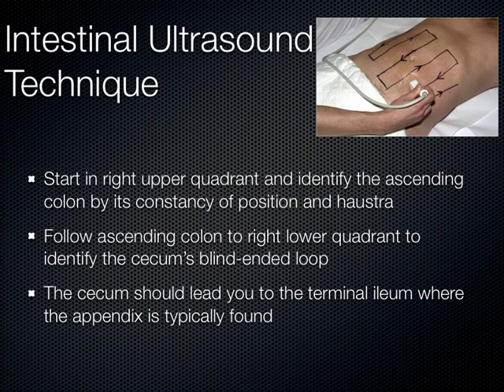Whereas in the small bowel, we have something called plicae circularis that do cross the entire wall of the bowel, which I'll show you in a minute. That's how we can quickly decide between small bowel and large bowel on any imaging study, looking at haustra versus plicae circularis. That sounds like minutia, but it actually comes into play quite a bit in most fields, so it's something you might want to remember.